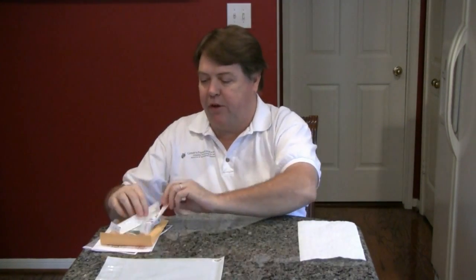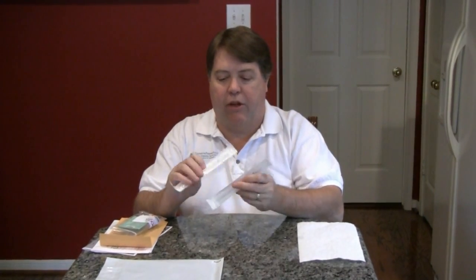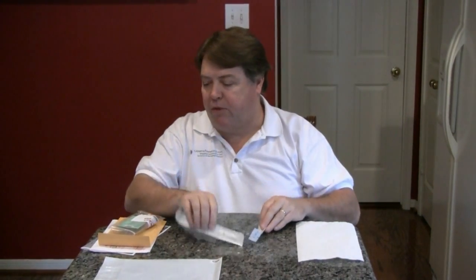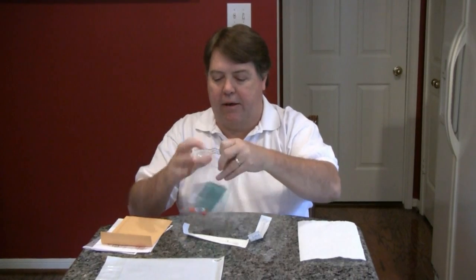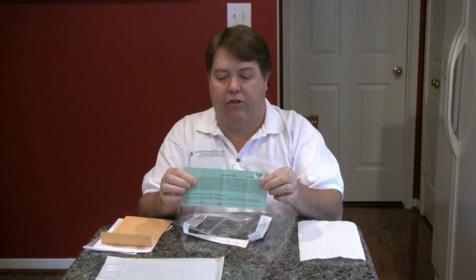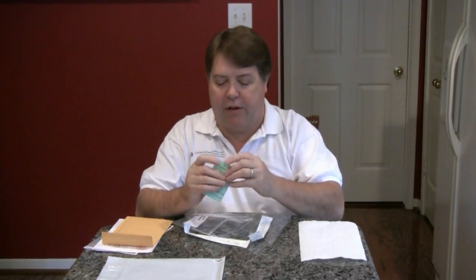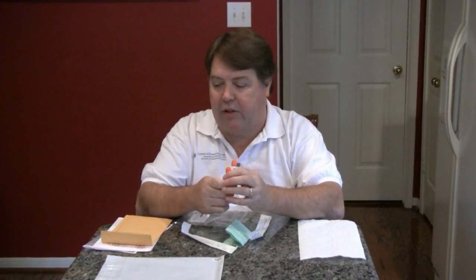In your packet from the lab you'll get two or more swabs. These are the scrapers we're going to use to scrape your cheek. You have a little bag with a release form or permission slip, which you need to read, agree to, fill out and sign. And you've got these test vials which contain preservative to preserve your sample on the way back to the lab.